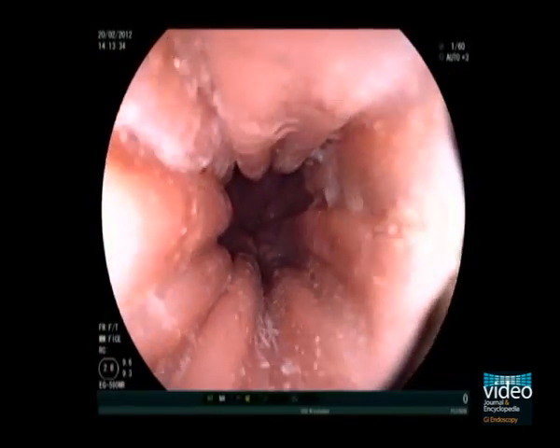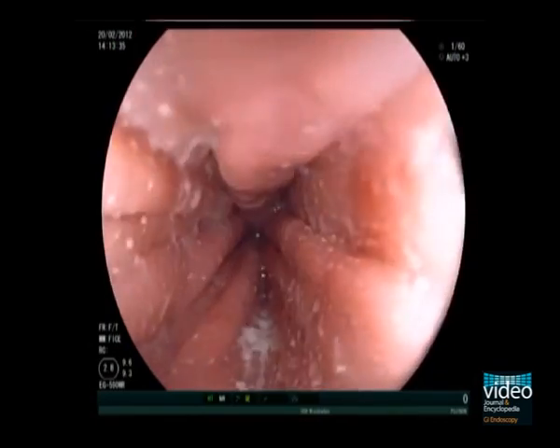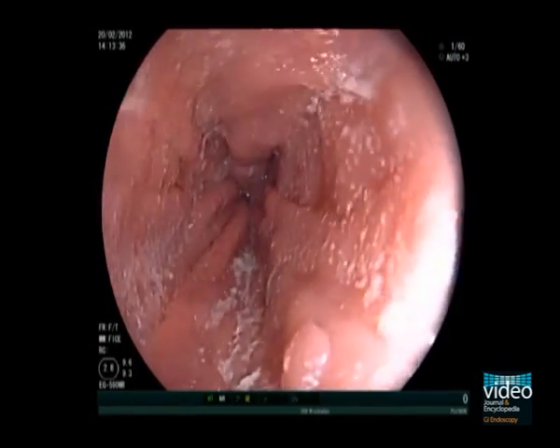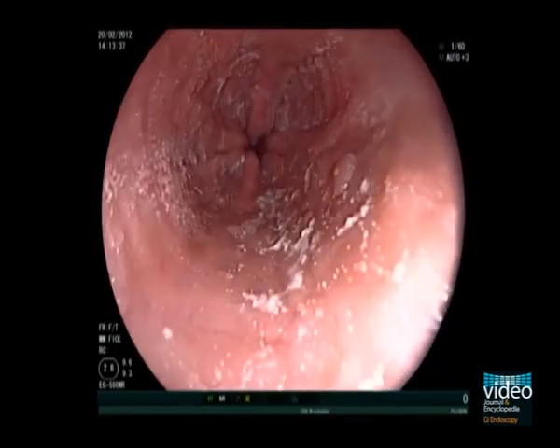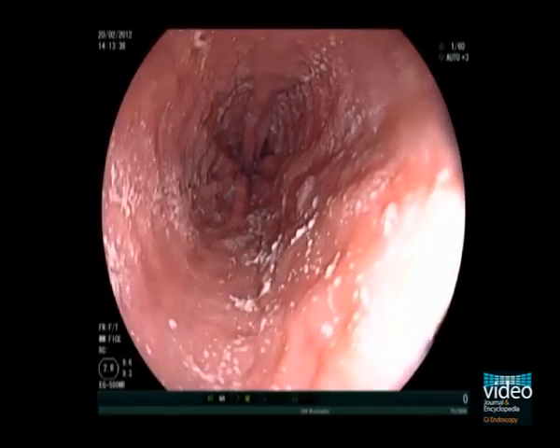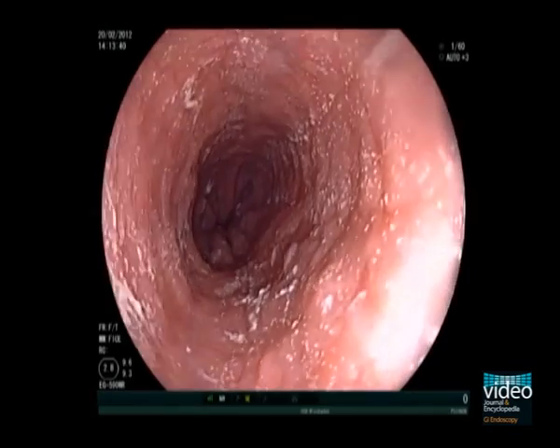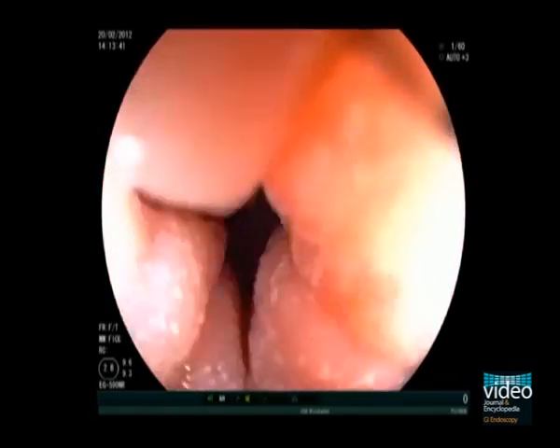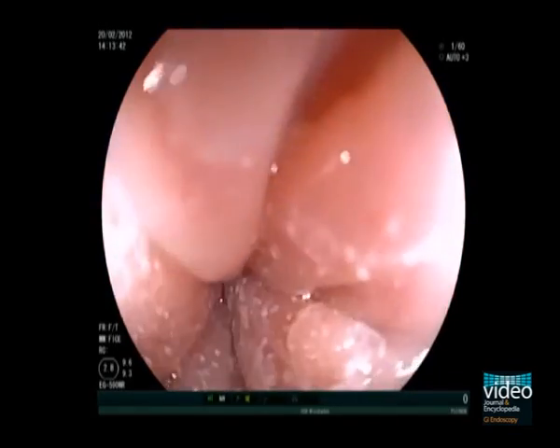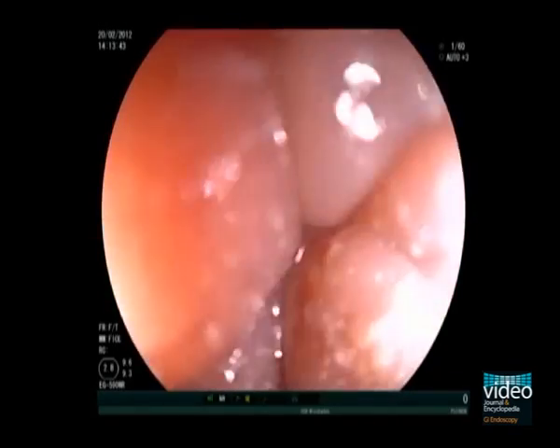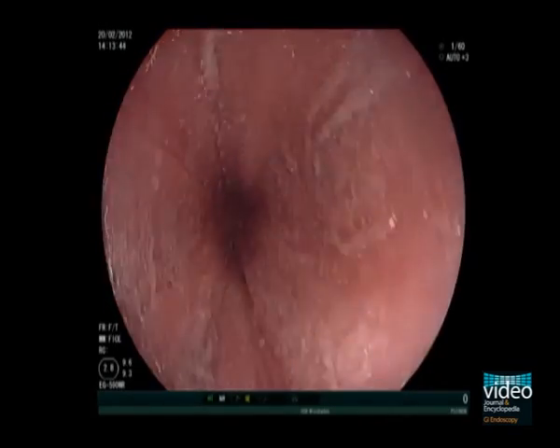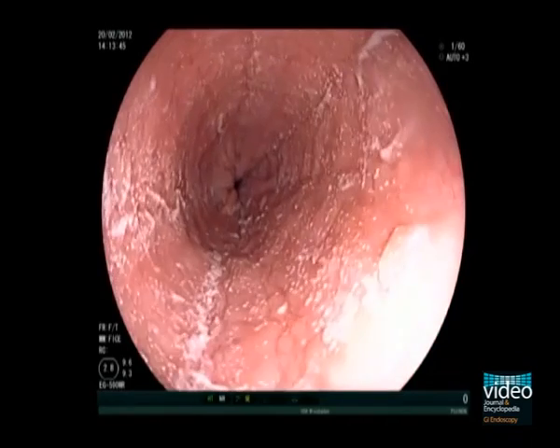This is another patient with eosinophilic esophagitis. Multiple small whitish papules can be observed here. These are eosinophilic micro abscesses, also a typical sign.